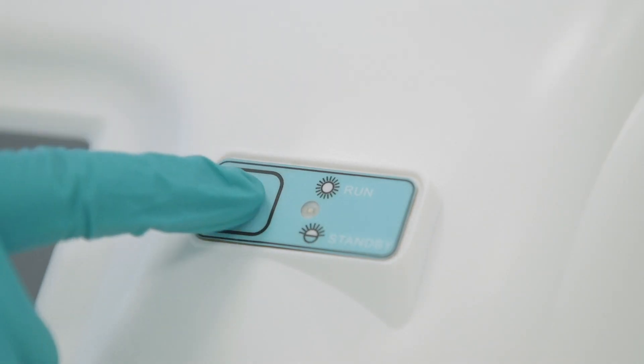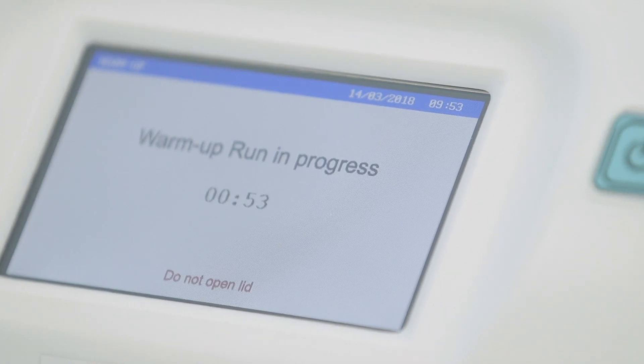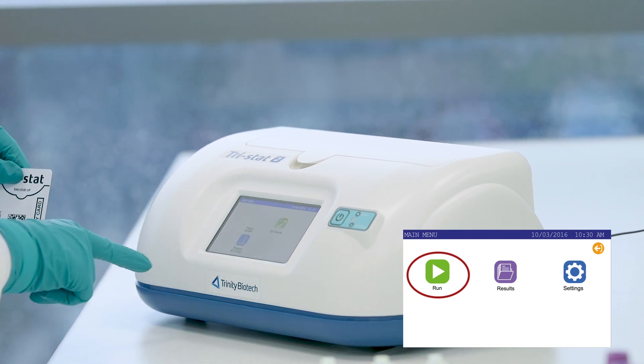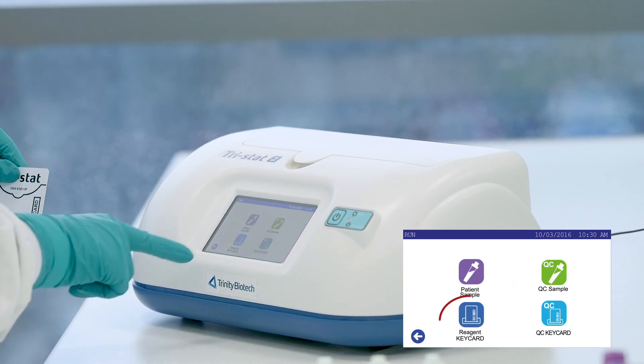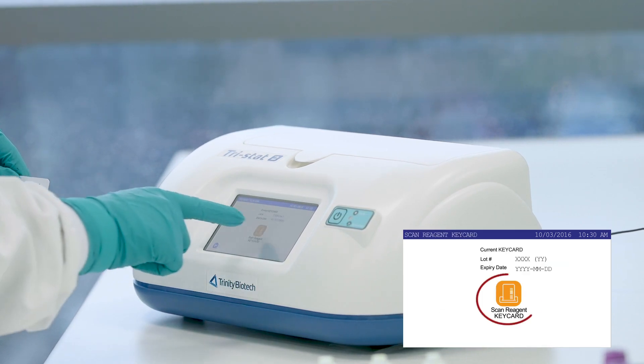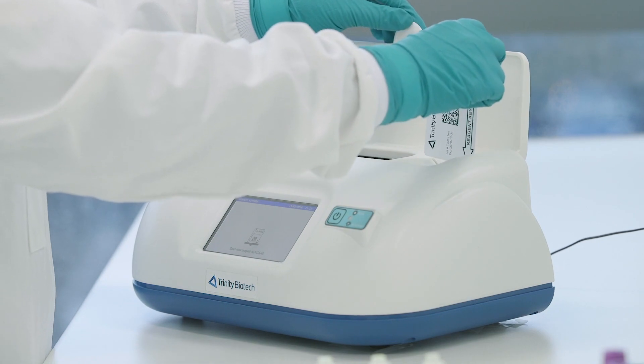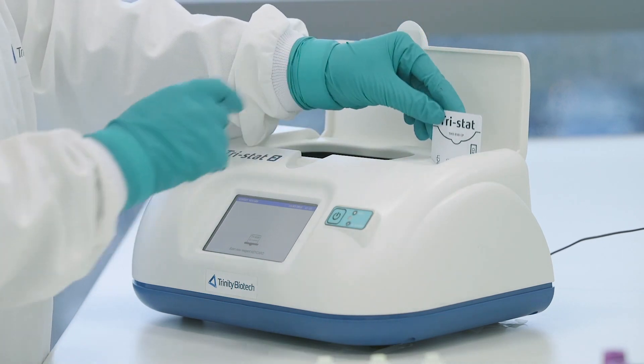Ensure that the Tristat 2 is on, the warm-up is completed, and the operator is logged in. Press the Run icon. Then press Reagent keycard followed by Scan keycard. Insert the keycard into the scanner and wait for the Success message.